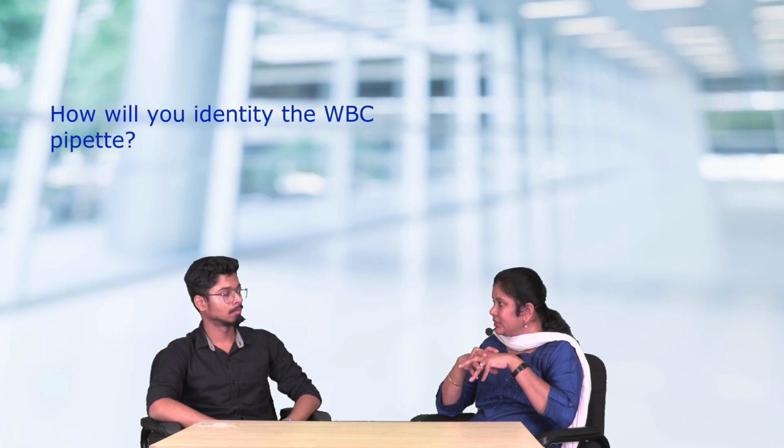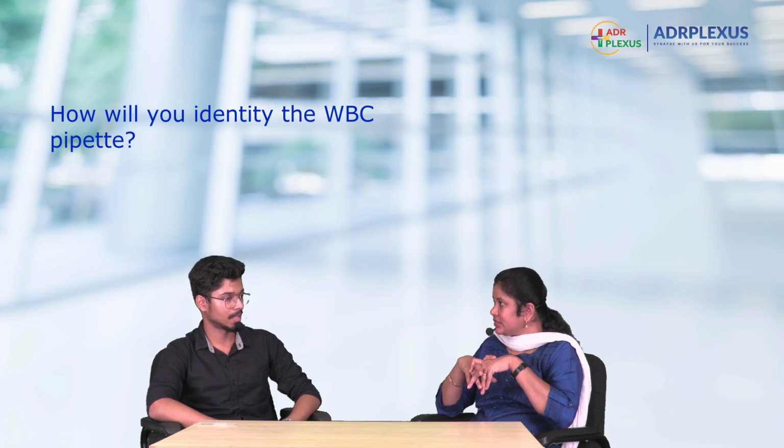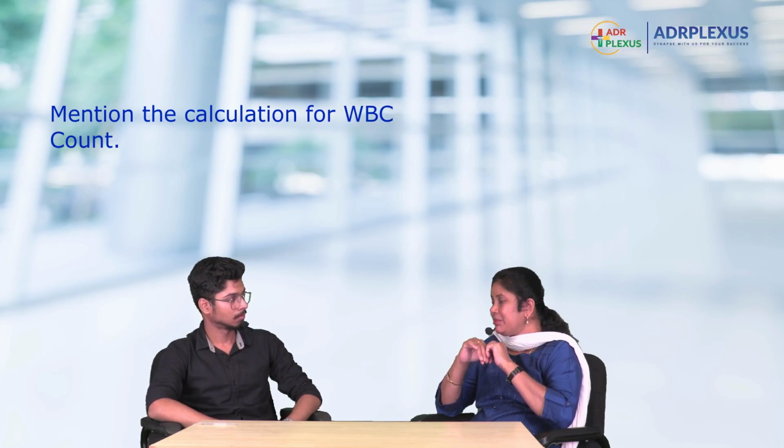Yes, ma'am. Right. Now the pipette, WBC pipette, how will you identify it? By the markings 0.5, 1, and 11, and the white bead will be there, ma'am, and there will be a white pore and a white mouthpiece. Okay. Fine. So everything is ready. The counting, the number of cells are also ready. Now you'll have to do the calculation in a stepwise manner. That is very important. The examiner will definitely expect the stepwise calculation. I repeated the same in RBC count also.